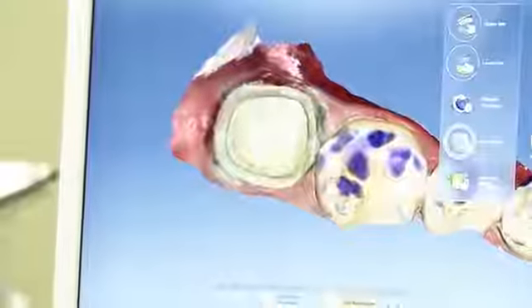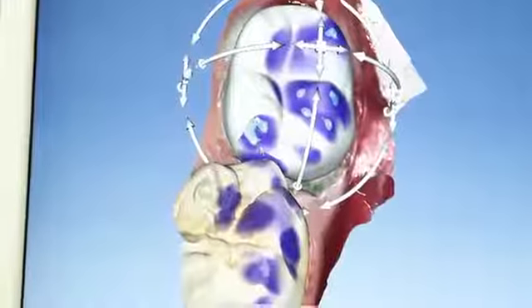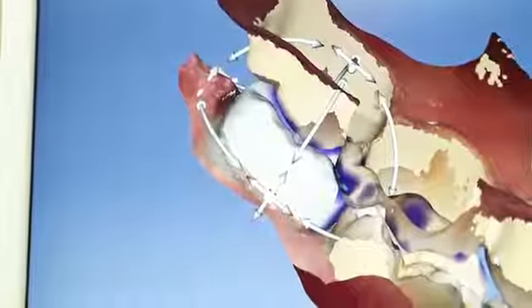So here is our 3D image of the prepared tooth. If I turn his tooth off, you'll see that tooth is angled in this plane, and the software did it exactly right. His old crown broke right here. See where it's colored right there? If you look at his opposing, he is bumping into that mesiolingual cusp. So we're going to reduce it a hair so that when he is in excursions, he's not beating up his teeth. So we're ready to press play and send it to the mill.